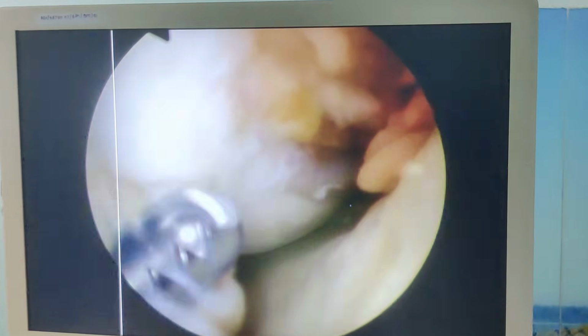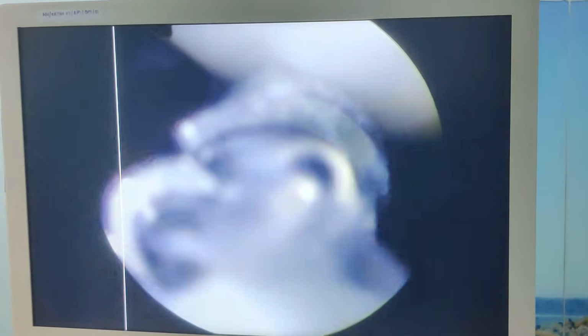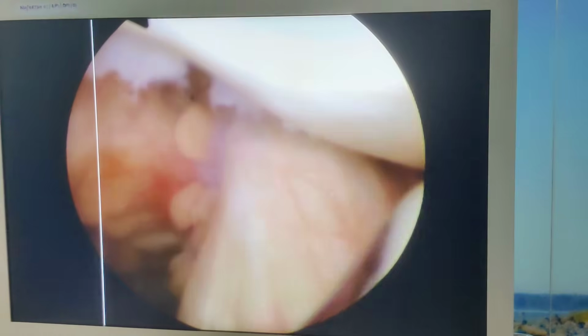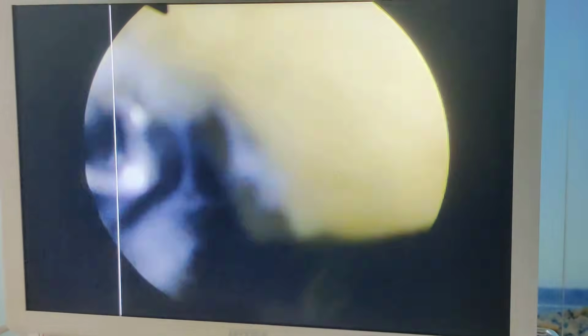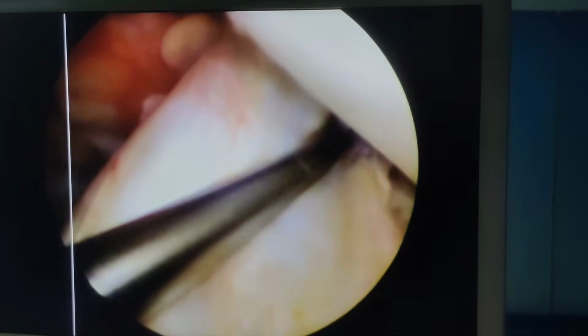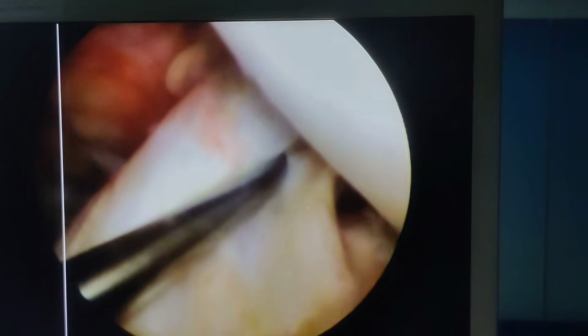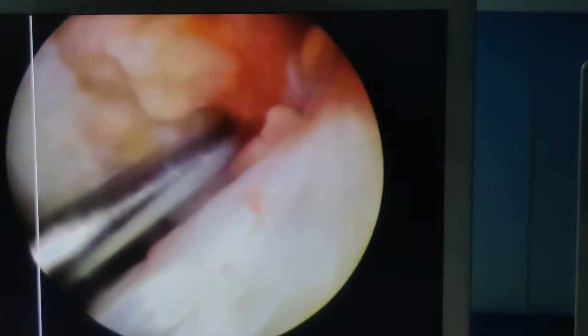Once you are inside the knee, you will do a general inspection. I am clearing the ligamentum mucosum, and once I have cleared it, I will do a general examination of the menisci, both medial and lateral, and if there is an issue I will address it, and once I have dealt with that, I will join you back and show you what to do next. So I have done the general examination and the knee itself looks pretty good. There are no degenerative changes. This is a young guy. The ACL seems to be pretty good, and clinically it was also good, and so was radiologically.